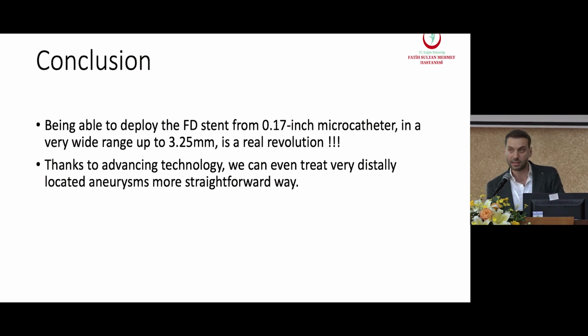And its opening, its conformability, its radial force is, I think, also very important, not to lose those features while maintaining a lower system compatibility.